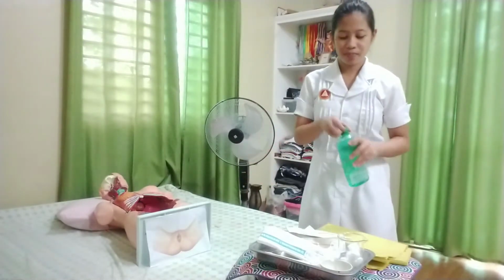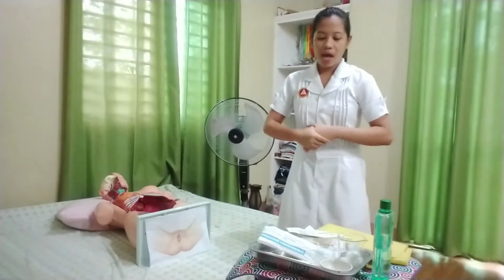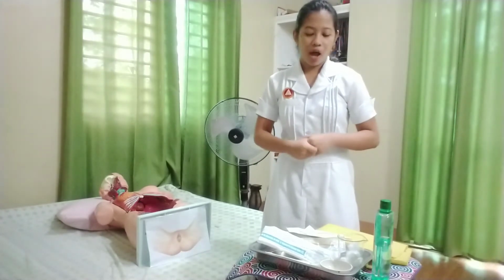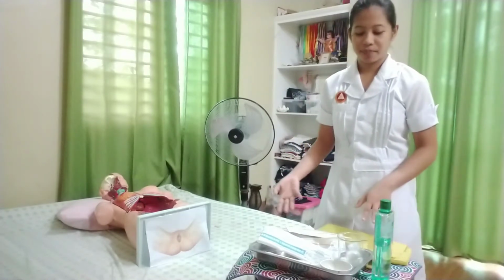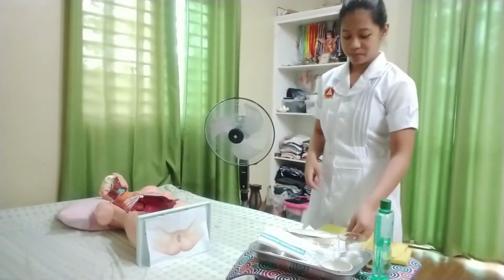So assuming that I've already done the perineal care, I will perform hand hygiene. And I will now prepare and open my sterile catheterization kit. So it is already open. It is important that when we open the sterile catheterization kit, it should be on a sterile table using a sterile technique. So I've already opened it. I will now put on my sterile gloves.